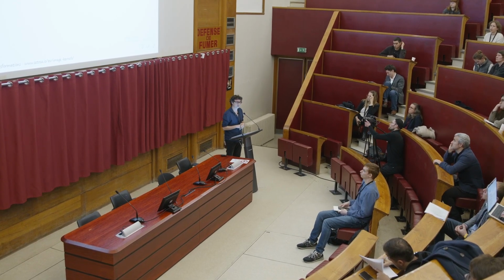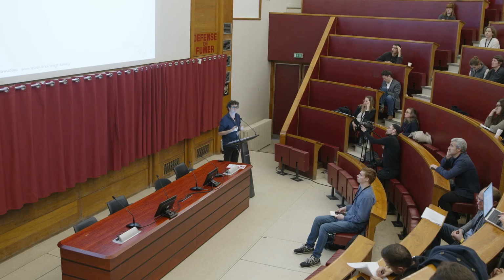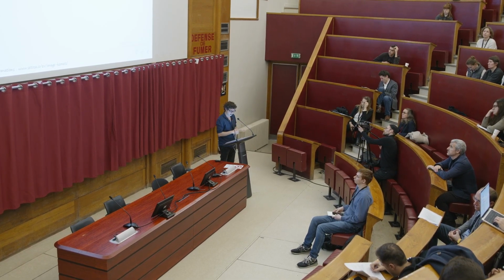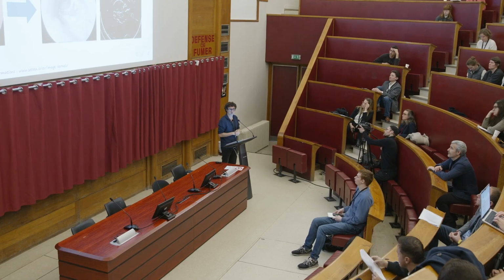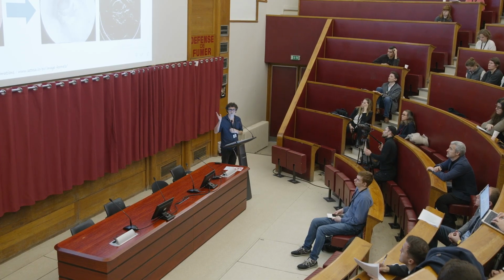If you continue and try to get more information about what's going on in the neural networks, well, the convolution layer, what is it? It's the idea of applying a filter, so a transformation to the image, and trying to keep the most predictive filters. So the aim is to start with input images, and then extract patterns that predict diagnosis in the images. In fact, I think you know this because it's used in most image processing software that you may have on your computer. So you start with an image, and then you apply filters, right?